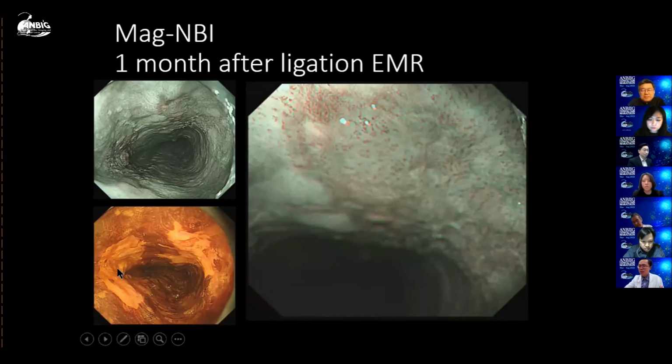Beneath the regenerative epithelium, so there may be the cancer. Yeah, maybe it's the same as Barrett's. Early cancer may happen. So yeah, it's very difficult without mapping.